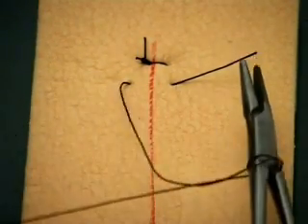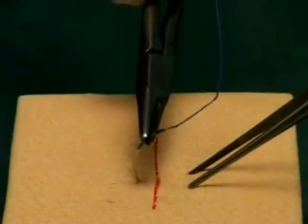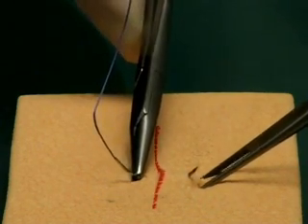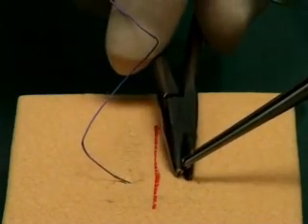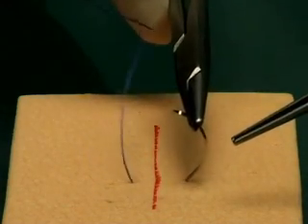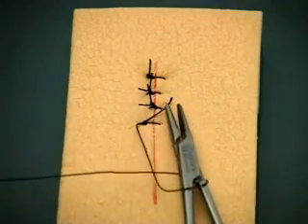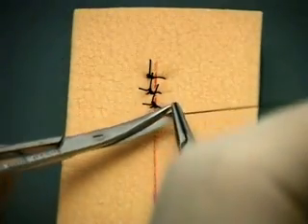Look again at the direction in which the needle enters the skin. Entering the skin at right angles helps to evert the wound edges. Observe how the needle is pulled out along the direction of its curve, which forms the arc of a circle. The simple interrupted suture is the easiest to perform and can be used for most skin suturing. Should the wound become infected, a few sutures can be removed without disrupting the entire closure.